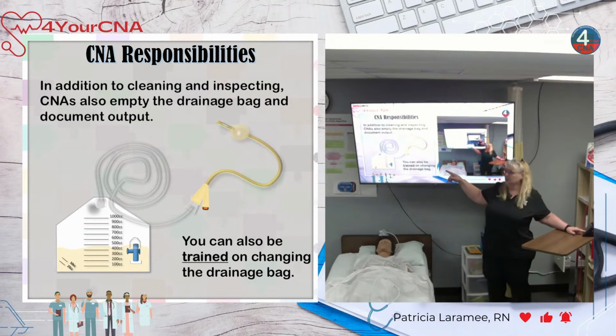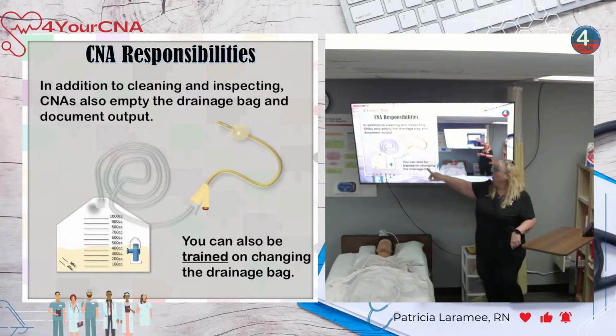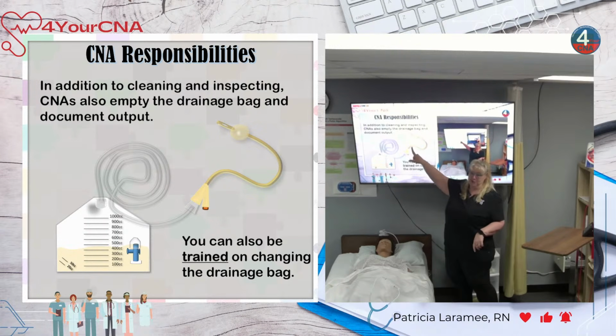Doesn't seem very hard, right? You unplug and you plug. Not very hard. But the problem is when we unplug, we've now allowed an opportunity for bacteria to enter much closer to the patient.